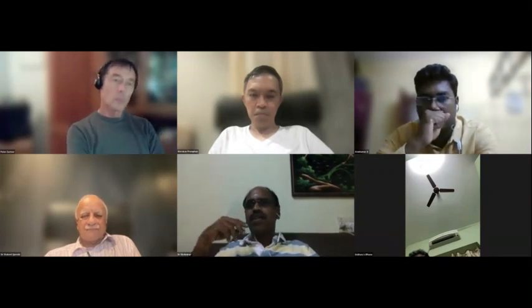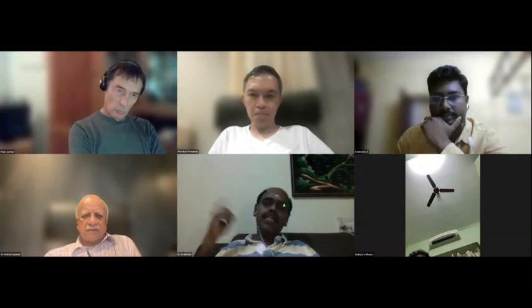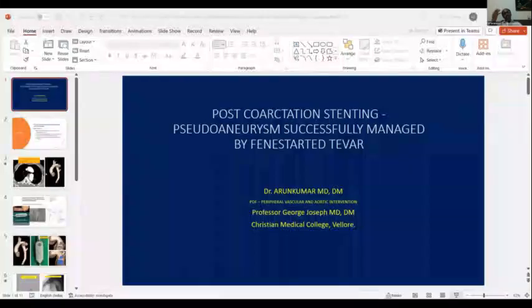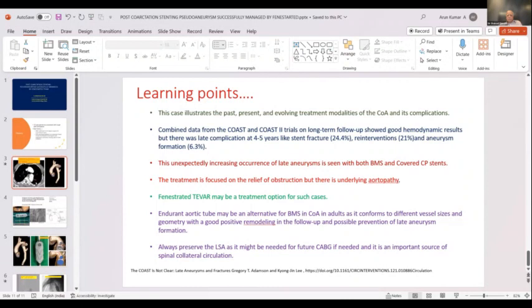But there was a second aneurysm that was a little distal. That was perplexing. And second thing, it was amazing that you were able to puncture through the chest and enter into that aneurysm sac and inject glue into it. Well, no, sir, that was back, sir. That was going to be my question, how you accessed, what position?